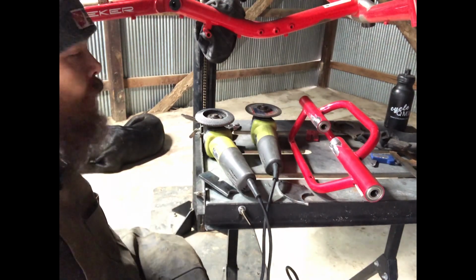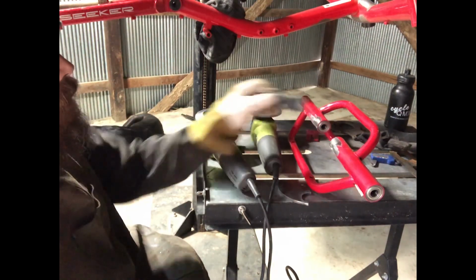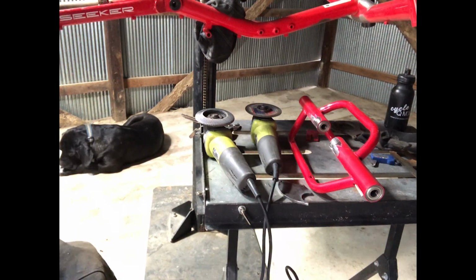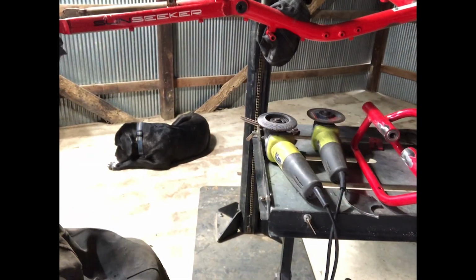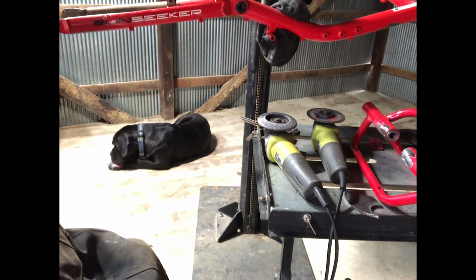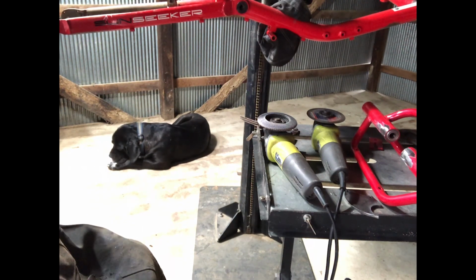On to the next part. I guess what we have left now that the grinding and the cutting and all that stuff is done is to go ahead and do our alignment. Go ahead and start lining stuff up. You clamp that on there.